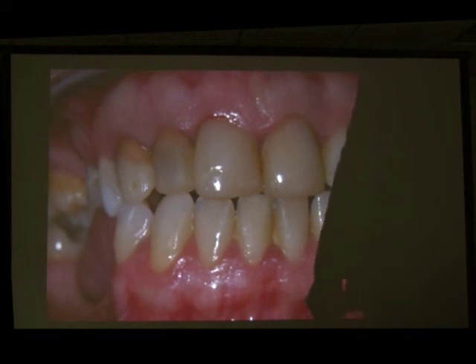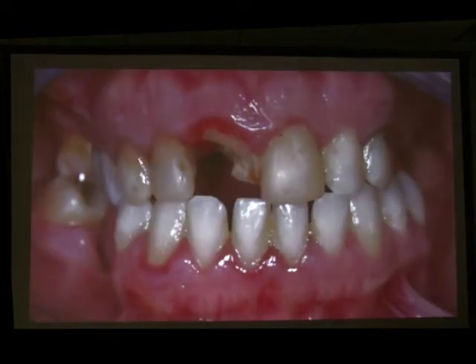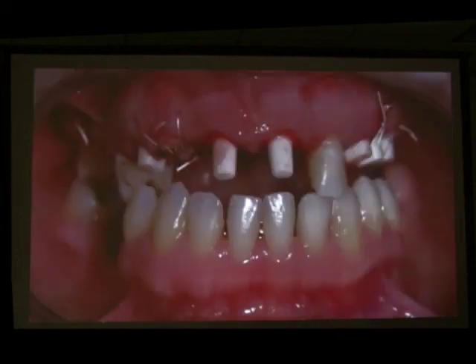The patient has to have extractions of teeth with apical lesions. So that's what we do, and we will only leave 2 teeth without any lesion. And also it's very good for proprioception, so we know that the patient will not bite more strongly than with his teeth.